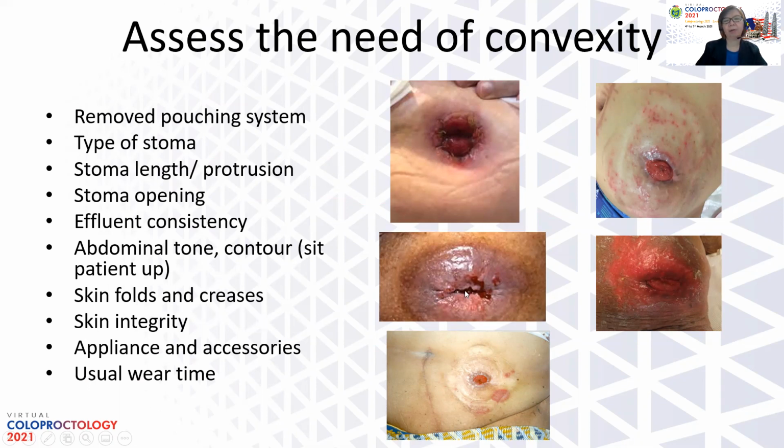And the skin integrity: if the skin is already broken like this, you cannot afford to use something that allows leakage to the side and causes the excoriation to become worse. So a good fitting appliance is very, very important for a patient who already has skin excoriation.